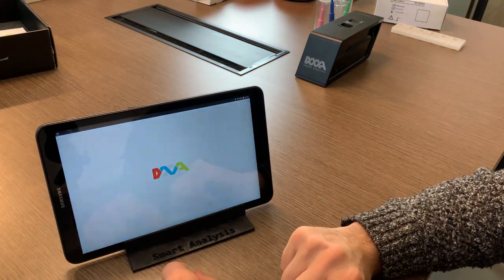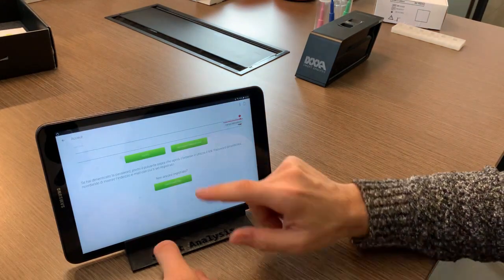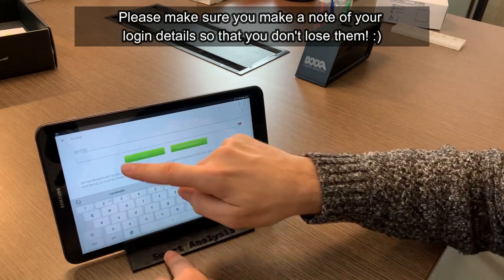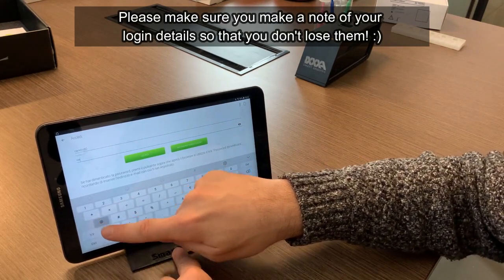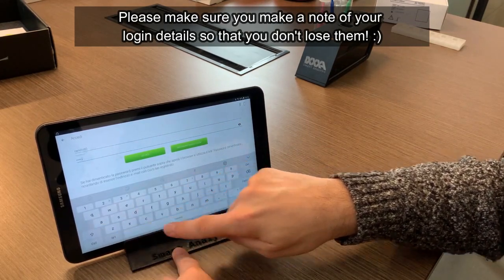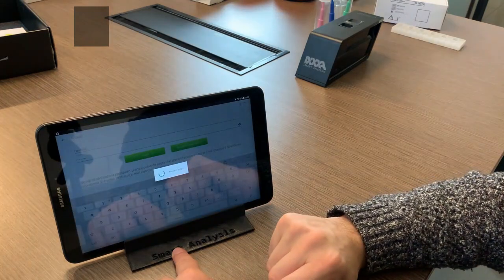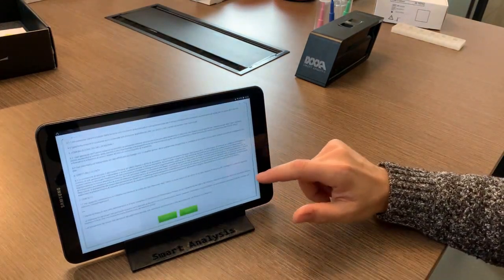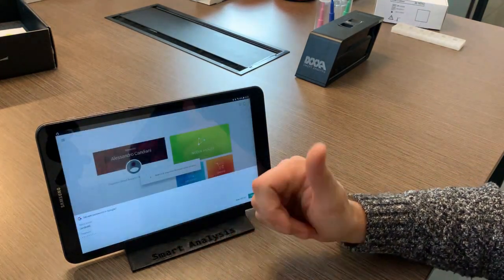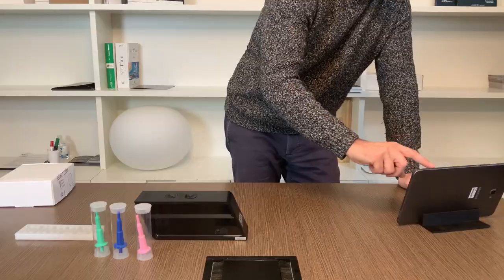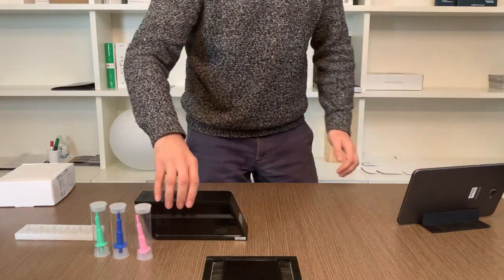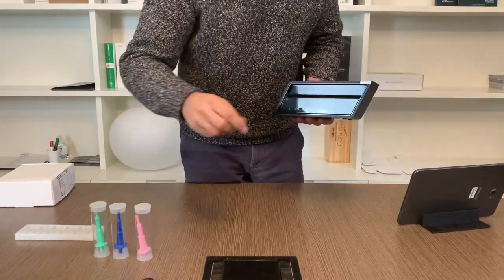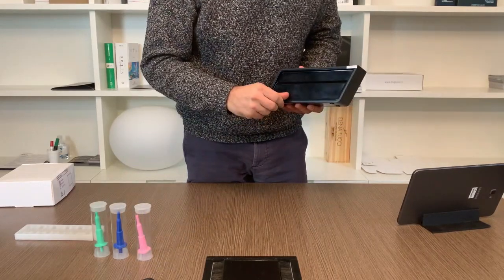Go back to the app and enter your username and password here as well and log in. Accept the conditions and you are on the main page of the app.